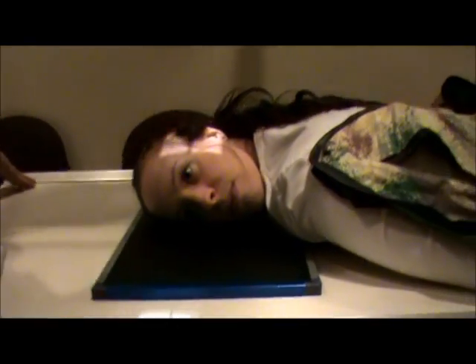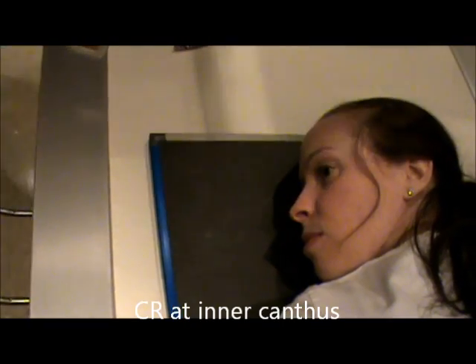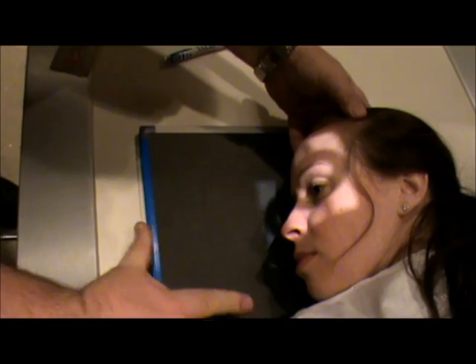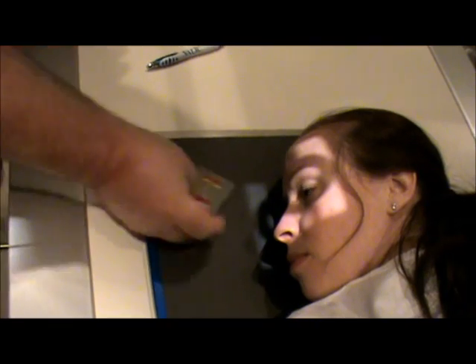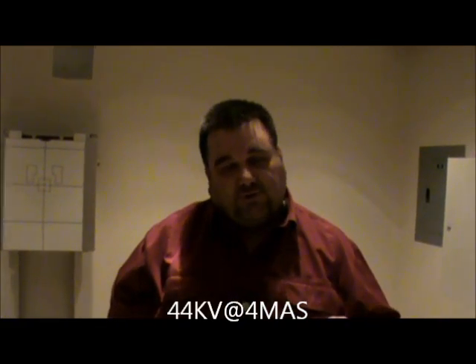We're going to center at the inner canthus using this line to get to the inner canthus. Collimation will be tight, and we'll adjust the film until it's centered. This is our right lateral, so I've got room for my right marker. The technique for this will be 44 kV at 4 mAs. If you remember when we taught you about the fingers, the digits were 44 kV — some students like to say same technique, like picking your nose: 44 at 4 for your finger, 44 at 4 for lateral nasal bones.